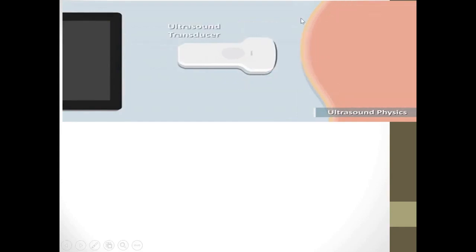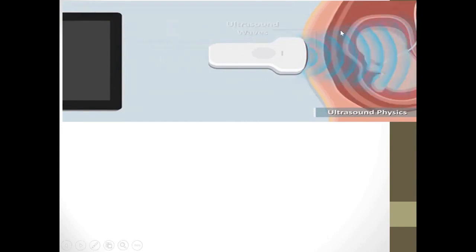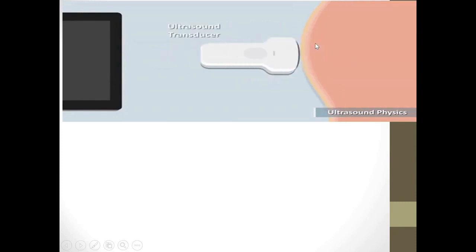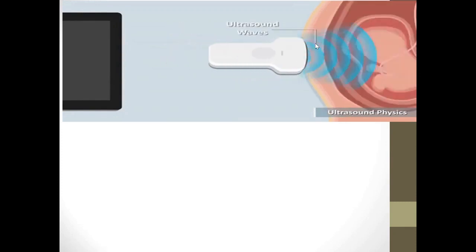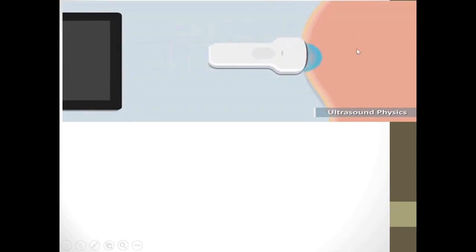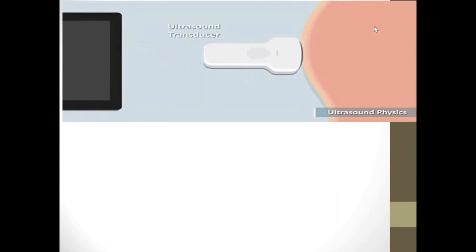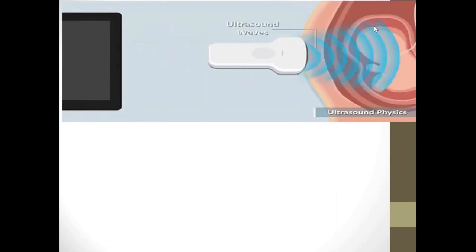All of this distinguishes the type of pulse. Is this pulse considered a short pulse or a long pulse? We will discuss all of this. Well, after the pulses start to enter the tissues of the patient, they will certainly undergo certain effects.